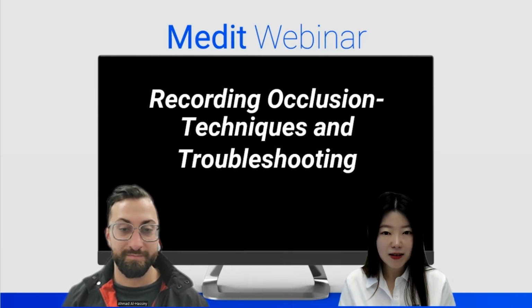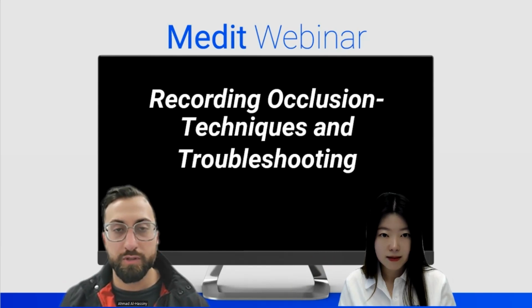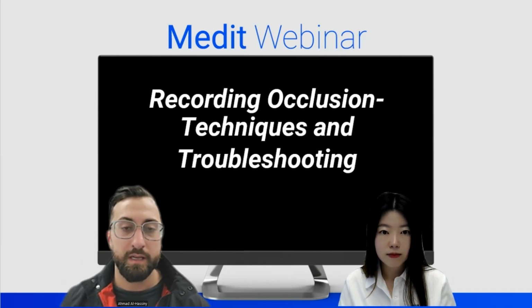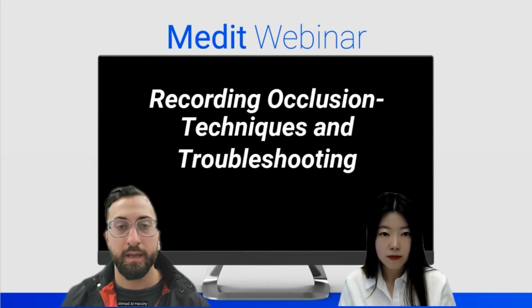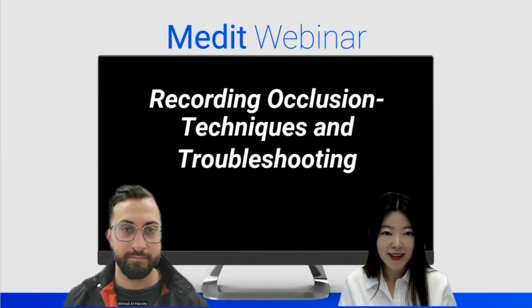Okay, so I think today's topic seems really interesting because it's about occlusion, and it's a key part when it comes to the end of restoring a prosthesis. I agree 100%. Bite scans, recording occlusion, is a critical part of the entire process, especially when we're sending things out to the lab. And I think it's a part that needs a bit of clarification and troubleshooting, as I see many users having some issues. We are very excited to hear about your clinical tips and experiences about recording occlusion.